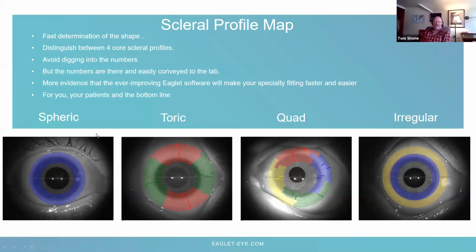Hold on a second, give me a chance to jump in. Unlike another scleral topographer that will remain nameless, we recommend 3 images because the patient's there and ready to go. So snap, snap, snap. It's not like we're merging these together with different gazes. It's just because they're there and you can pick the best image. It's good practice with any measurement device: never rely on a single measurement. Always take more, and have a quick look if they are reasonably comparable. If they are, you know you can trust the data.